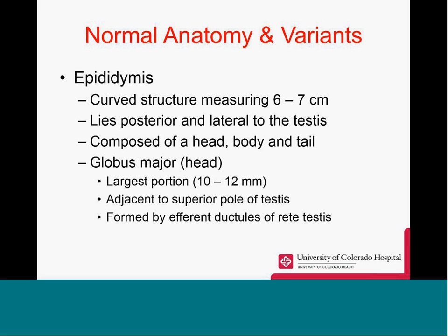Now the epididymis. It's a curved structure measuring approximately 6 to 7 centimeters. It usually lies posterior and lateral to the testis. It is composed of a head, body, and tail. Starting with the head, it's also termed the globus major.